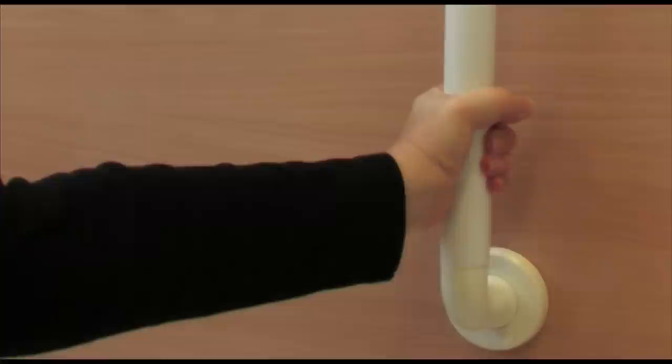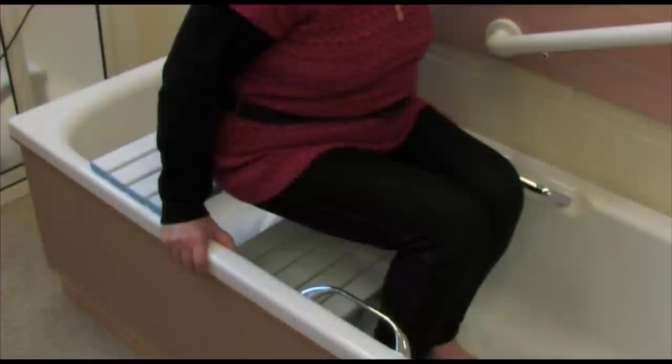Having rails fitted to the wall will provide additional support and can be used to aid standing when taking a shower. If you've filled the bath, having tested the temperature of the water first, you can now use the seat to bathe.